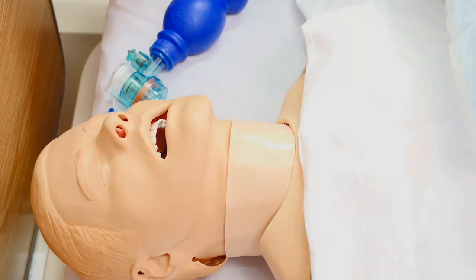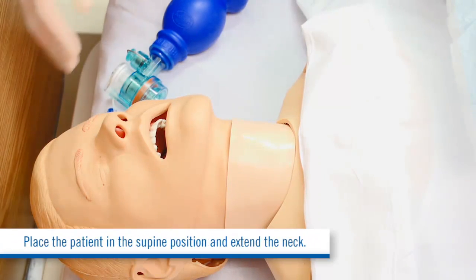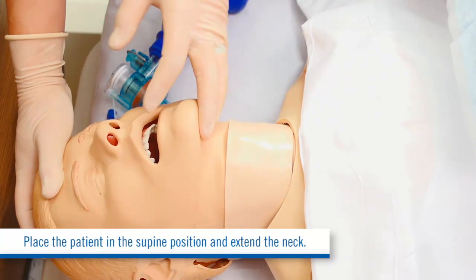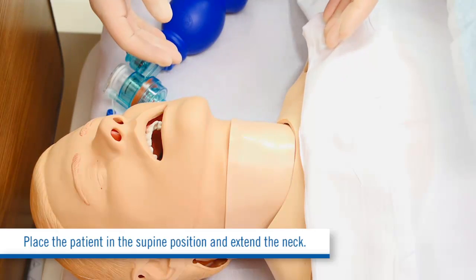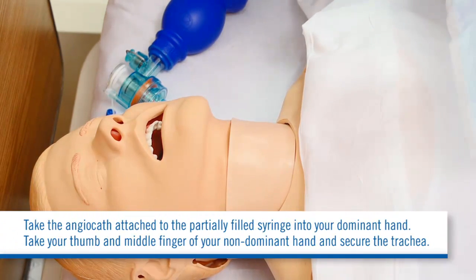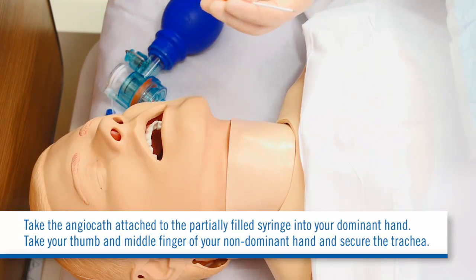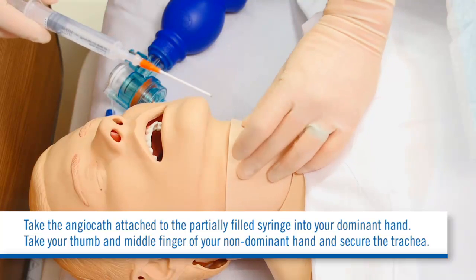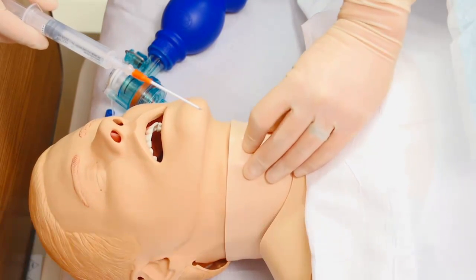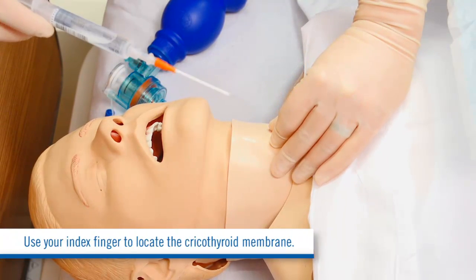Now to the procedure. Place the patient in the supine position and extend the neck. Prep and drape, gown and glove. Don't forget your face mask. Take the angiocath attached to the partially filled syringe into your dominant hand. Take your thumb and middle finger of your non-dominant hand and secure the trachea. Use your index finger to locate the cricothyroid membrane.